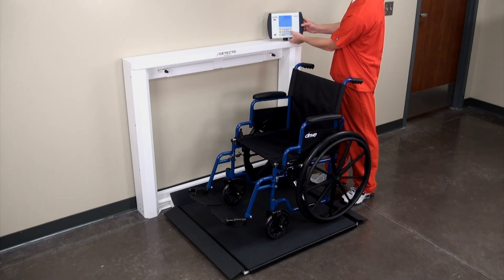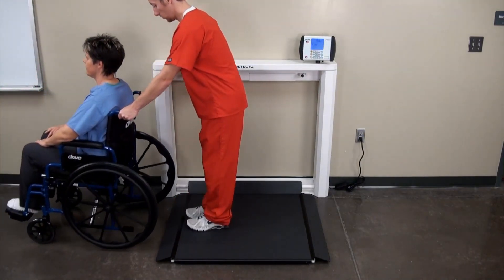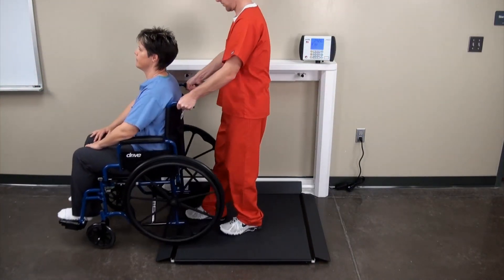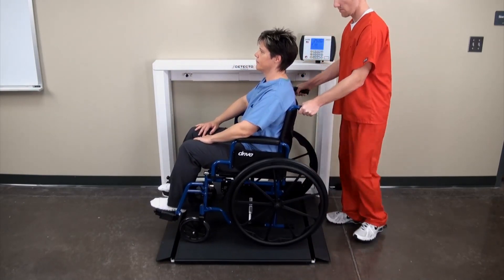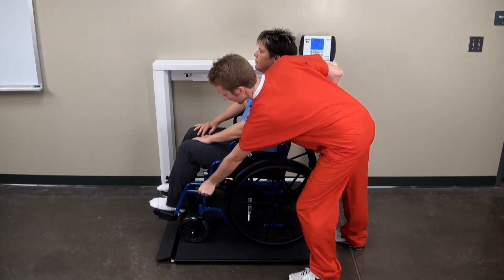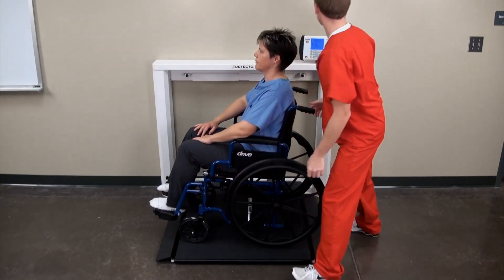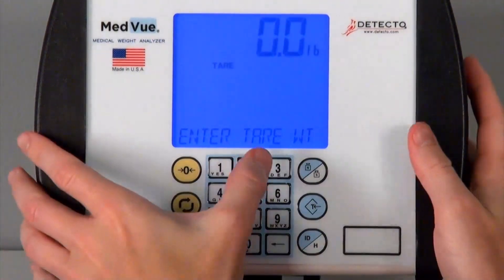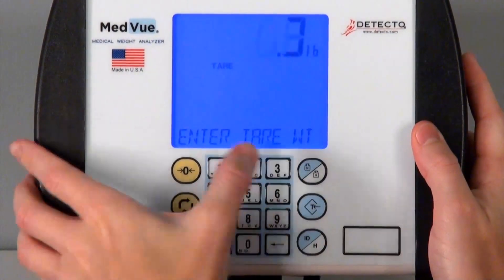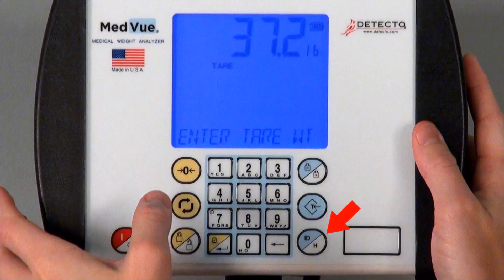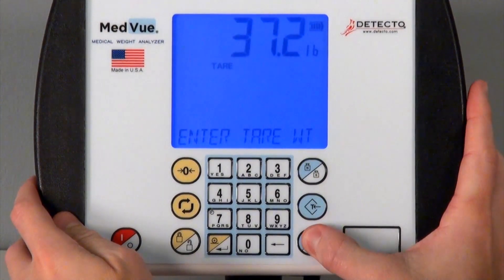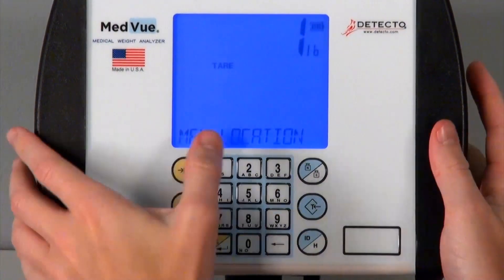Tare weights can also be stored and later recalled. This allows you to enter the weights of several different wheelchairs into your scale's memory and recall them later when using those wheelchairs to weigh patients. After entering or measuring the tare weight of an object, instead of pressing the Enter key, simply press the ID Height key. The display will then change to ID.